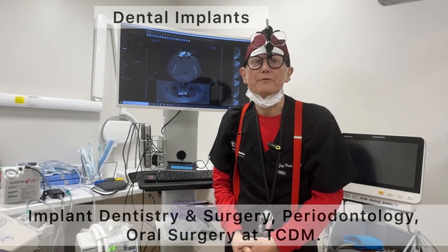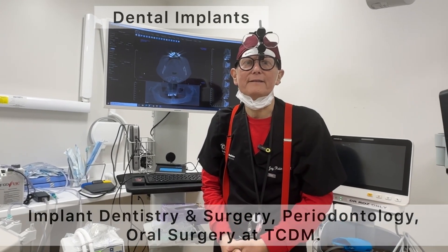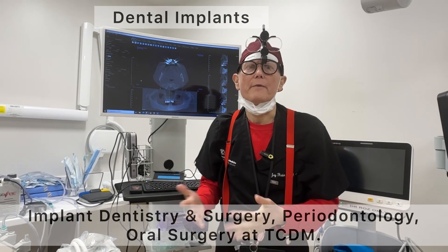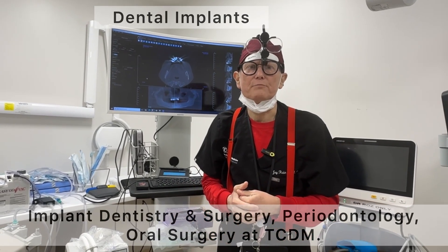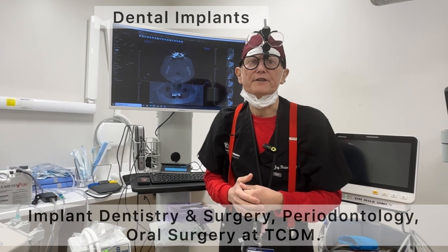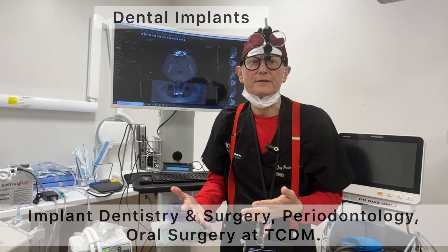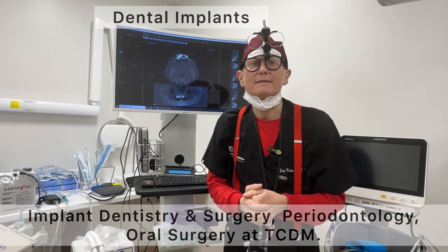Hi, I'm Dr. Jay Rubin, co-director of implant dentistry and surgery. We're about to perform a very complex surgical procedure where the patient is going to have her remaining teeth removed and placement of dental implants.